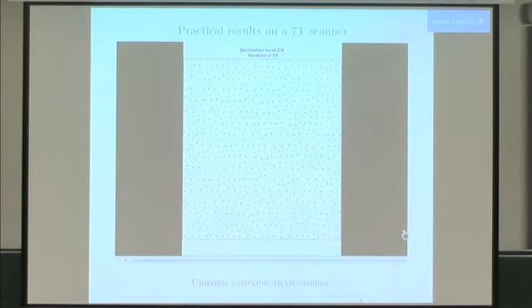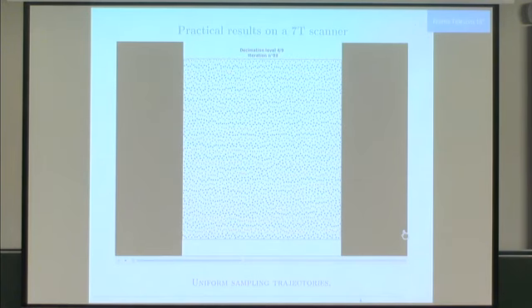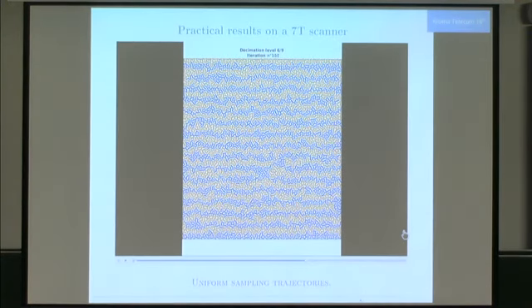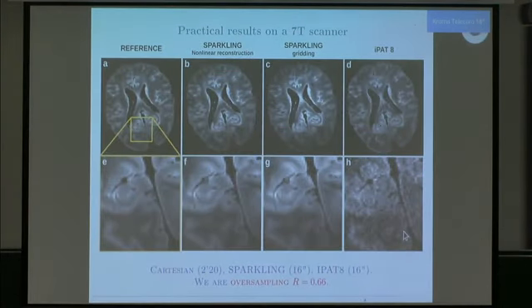I didn't say it, but it's multi-scale. Here you see how the trajectory is generated. And then you can use it to try reconstructing images.